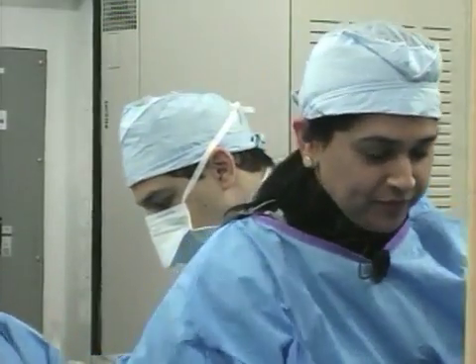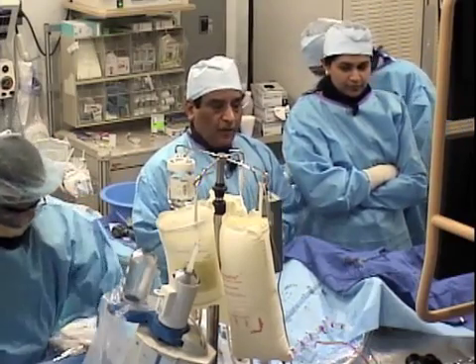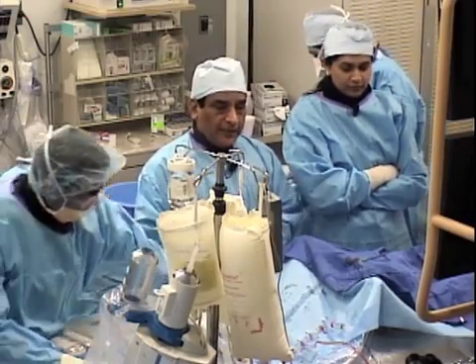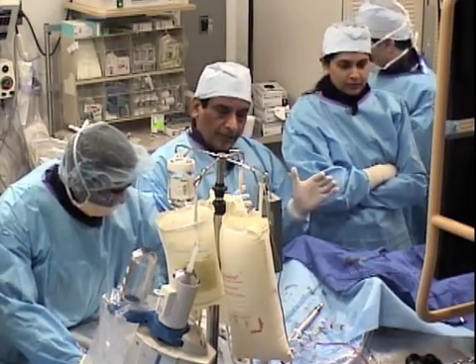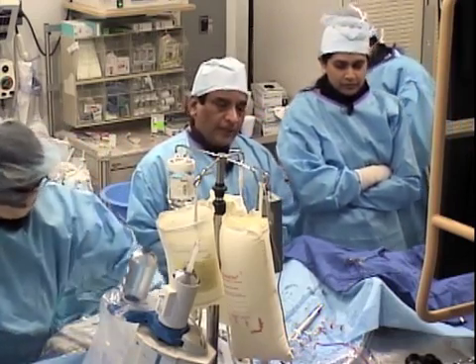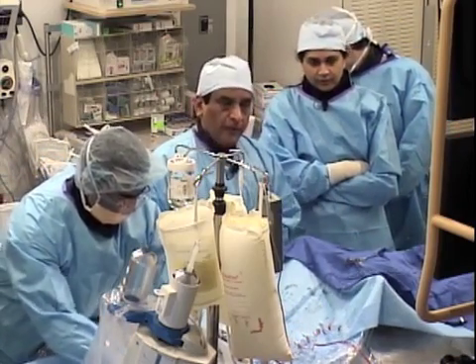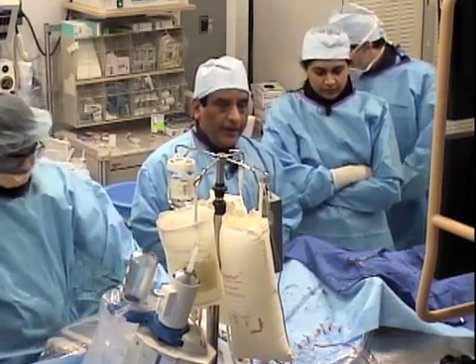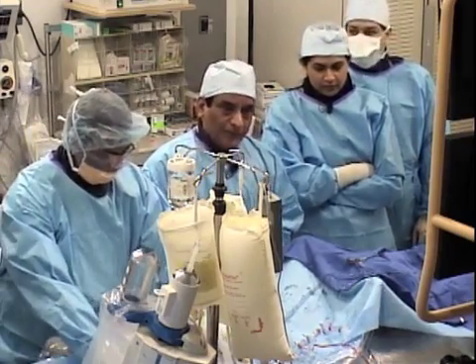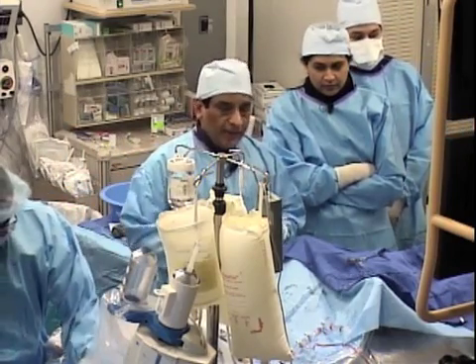Okay, now with that note, we will start, we are not ready yet. The slide of the case, because just to reiterate the format, we will make a presentation of the case history, then the patient's angiogram, and then some relevant talks relating to that particular case for about 10 to 15 minutes, and the remainder of 40 minutes, the major part of that 1 hour, is devoted to performance of the case, and of course the live feedback, the question answers, with Dr. Mehta moderating.